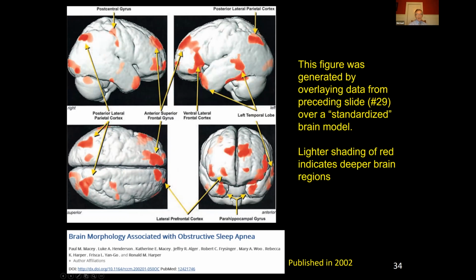And also this hippocampal gyrus is an interesting area because on MRI, that's one of the toughest regions to image. So people over the years really wonder if this is true. Even in our data, it's really tough because of the bone structure of the skull to get good imaging in these areas. So that may or may not be actual. The prefrontal cortex work, though, we're pretty convinced is there.